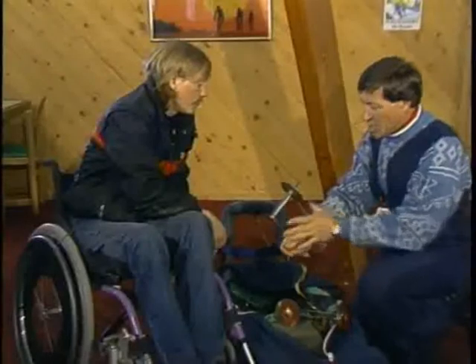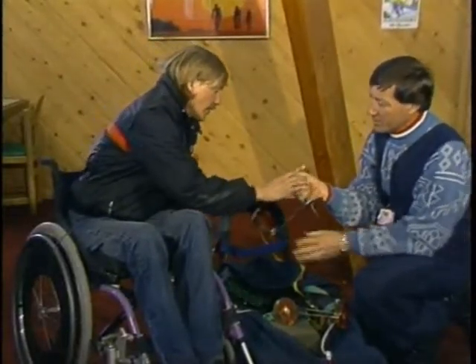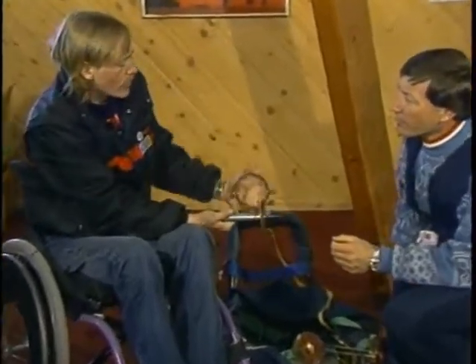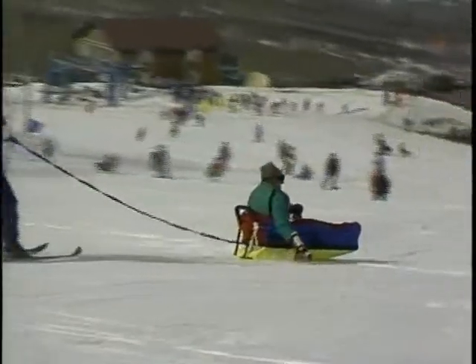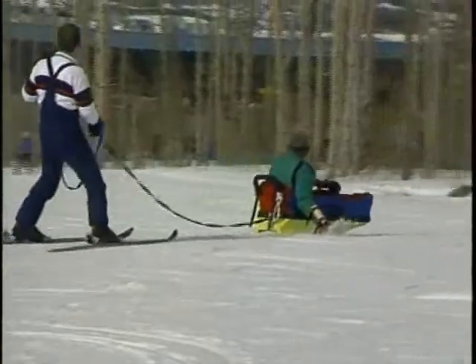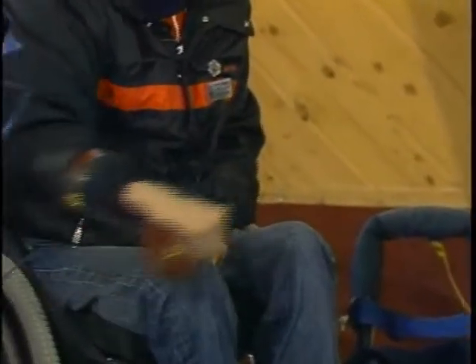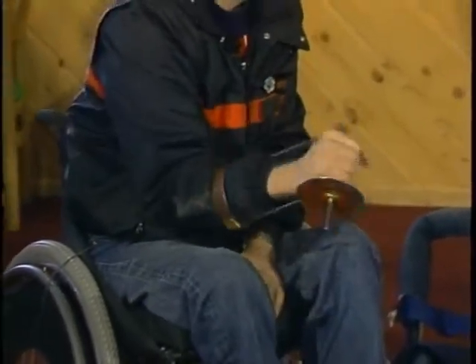What's the advantage you have in this part rather than just a pick that you would hold like this? Well, they do have picks that are just straight, and they don't have this force. That really gets to the wrist, because when you're putting it down, the old wrist really takes some torment and anguish, especially in ice. So when you have this, then when you put this thing down, you're getting all the pressure. You're using your forearm and your shoulder more than the wrist.